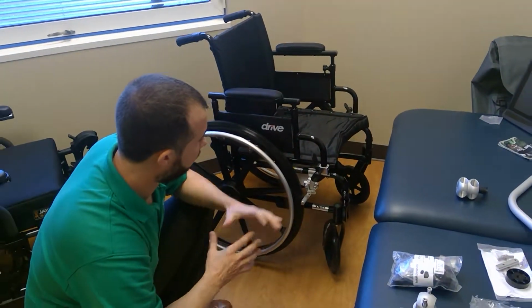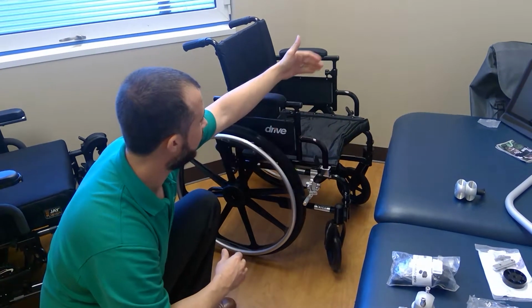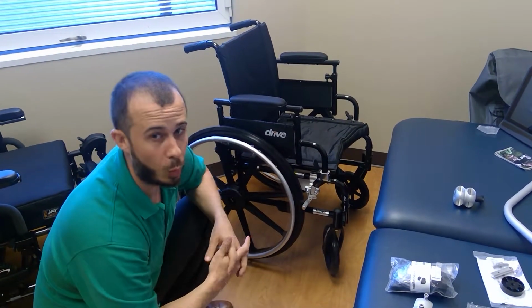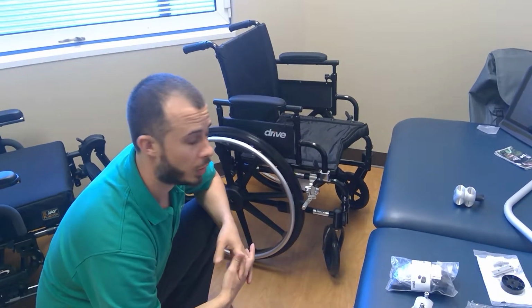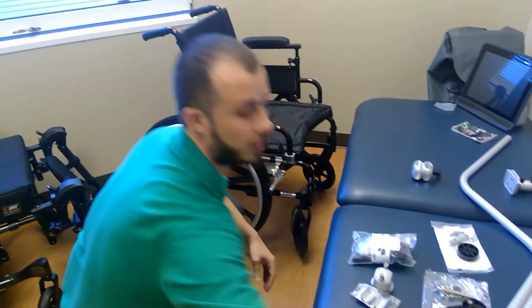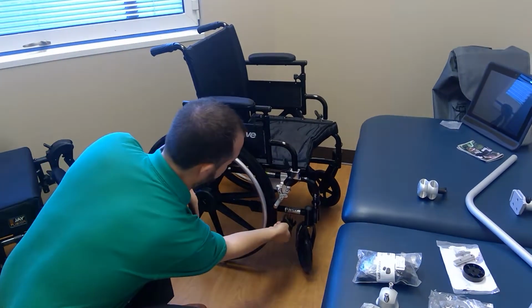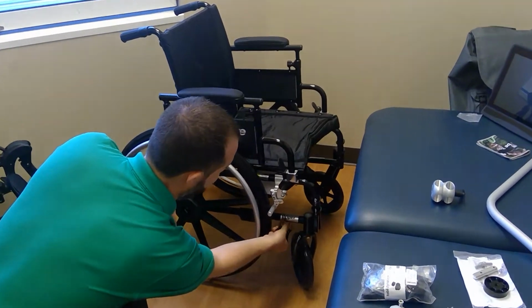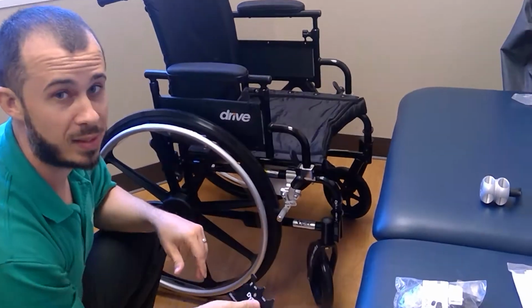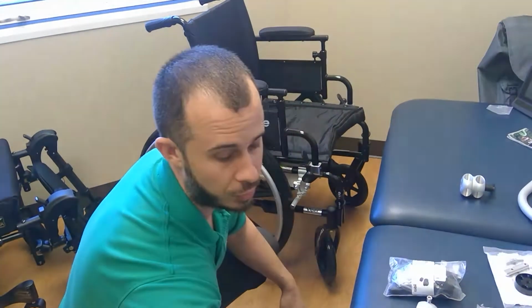Once we've figured out what area of the chair we want to mount to, whether it's the right side, the left side, and which tube location we want, we need to figure out what the size of that tubing is. So your Tobii Dynavox rep will most likely have a nice little handy tool that's easy to use, something like this, where we can just come up to it and say, find the right size, and we know that that's a 1-inch tube. Well, that's nice and easy, but you might not have something like this laying around. So there's another way to do this.